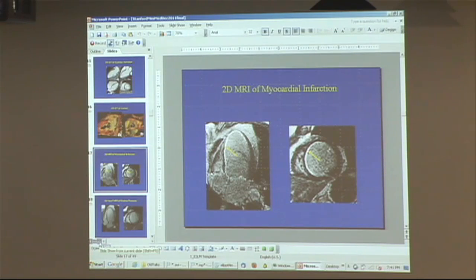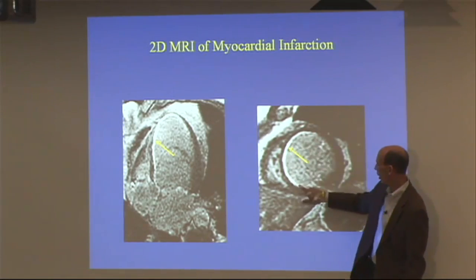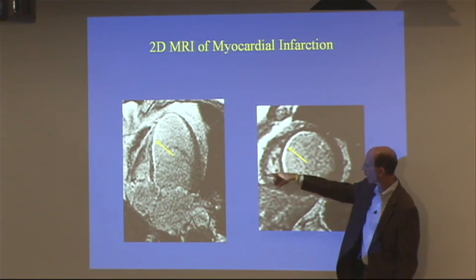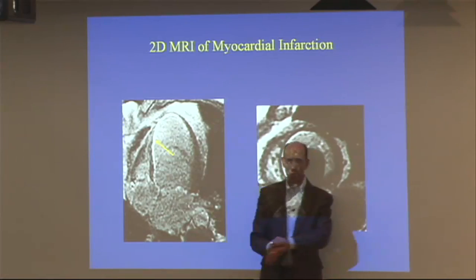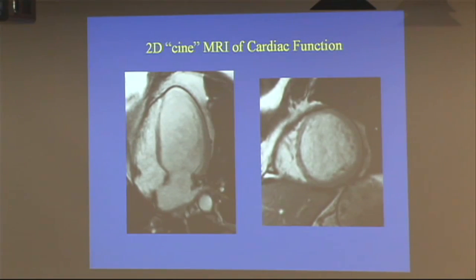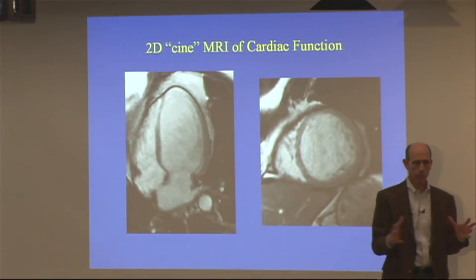Switching to MRI: this is a static 2D image showing how MRI can detect past heart muscle damage. A contrast agent was given and the resulting bright signal indicates a prior heart attack in that region. In the same patient, you can also evaluate the squeezing function over time to see how the damaged area affects cardiac performance.